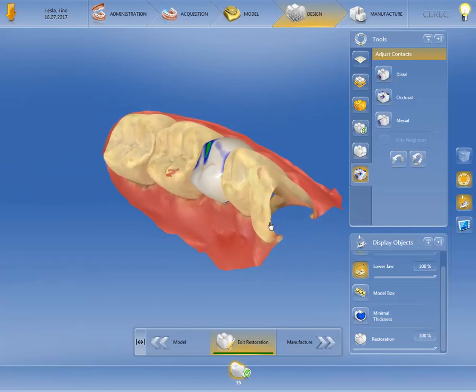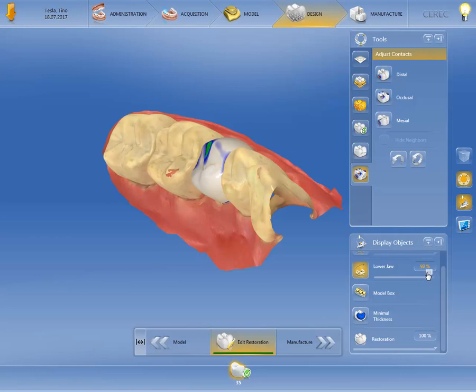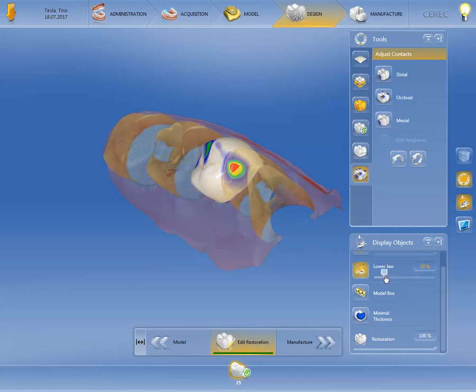You can adjust the intensity for the lower jaw individually with the slider. As an example, we are going to adjust the mesial contact point.